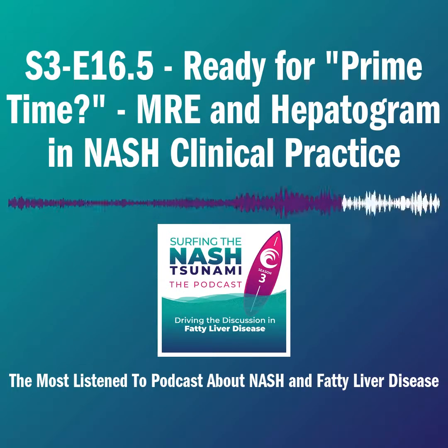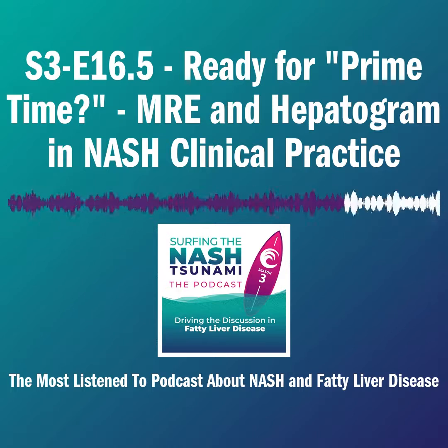Sure. Well, I'm going to tell you just a very quick, funny story. The very first clinical MRE that I ever did failed miserably, and it was in a patient with, in retrospect, a serum ferritin of about 10,000 and had iron off the charts. And so in severe, extreme iron overload, MRE can fail. The technical success rate of MRE is well over 95%. So it's very uncommon that it fails, but in these cases it will.